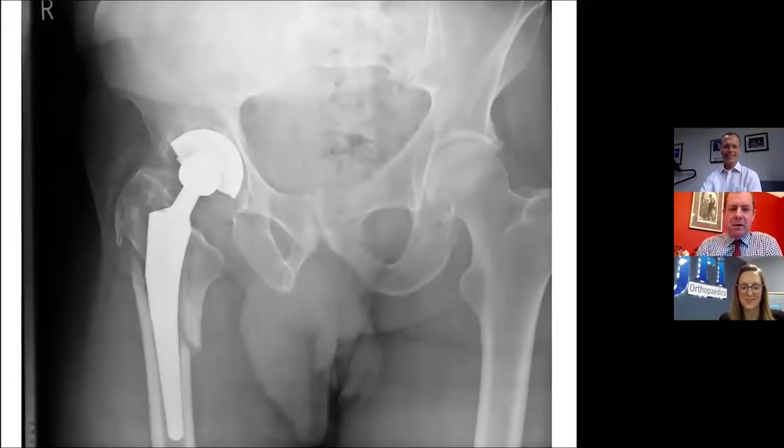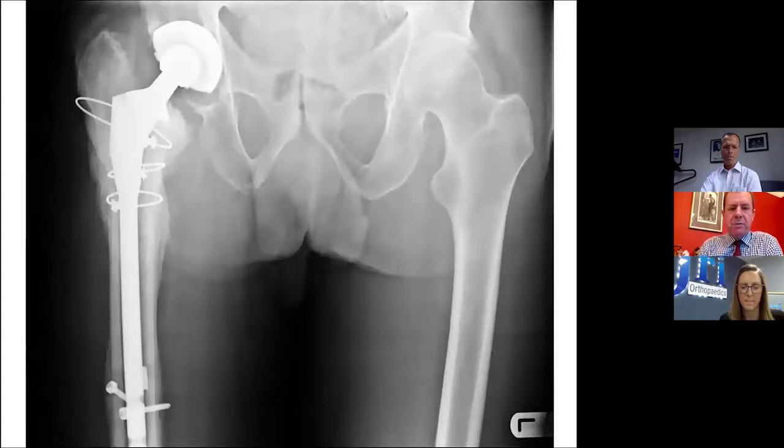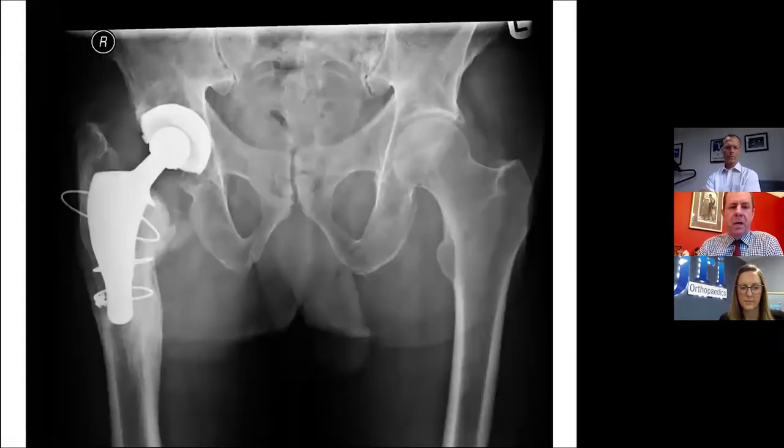So this is a periprosthetic fracture sustained in an old uncemented implant. The stem was loose. It was revised with a distally locked long HA-coated stem, which never bonded. This is a one-year x-ray. So the fracture had healed. There was no infection, but there was ongoing pain from a slowly subsiding implant. And so I revised that in a single stage to an evolution. So that's going from a very, very long stem to a very short stem. And I think that is a size 17.